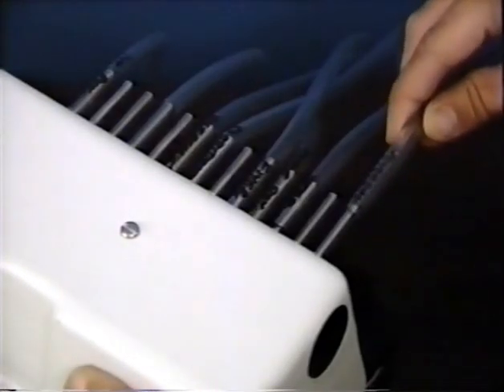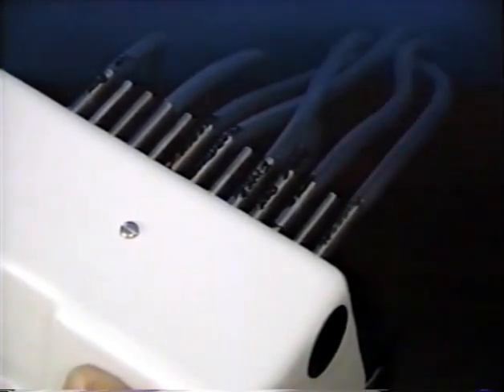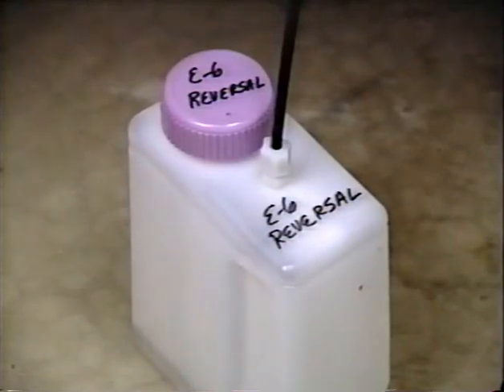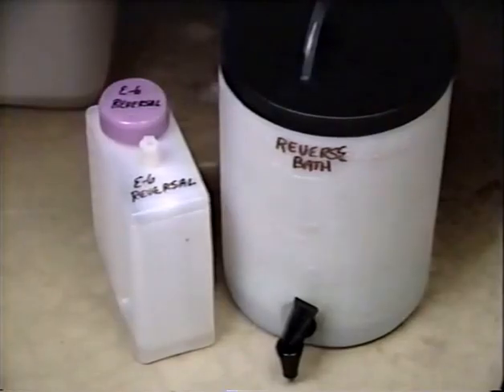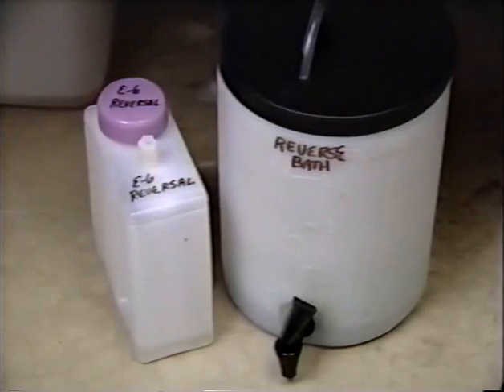On the back of the unit there are 13 chemical tubing connections for pumping of chemicals located in containers underneath the unit. The unit can use the two-liter containers supplied with the processor or any other suitable chemical container. If your volume of film runs is heavy, you can easily run the chemical tubing lines into a larger container and thus reduce the frequency of chemical replacement.